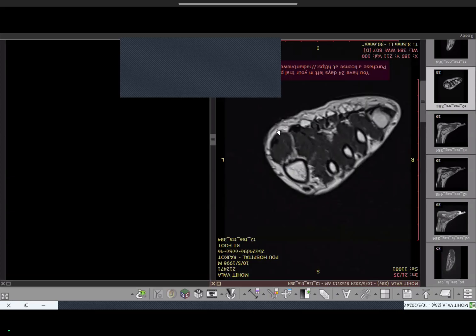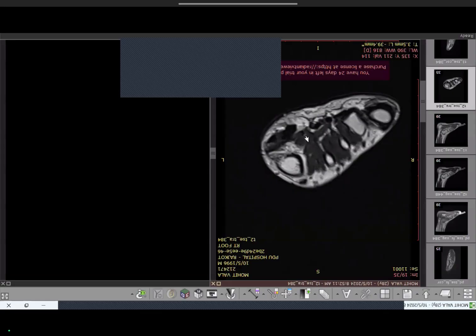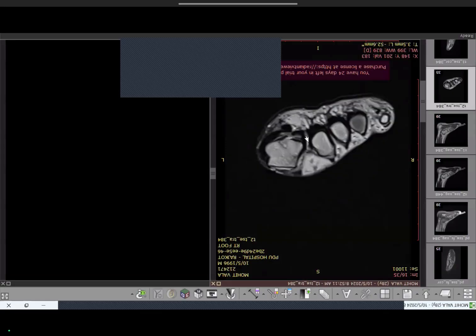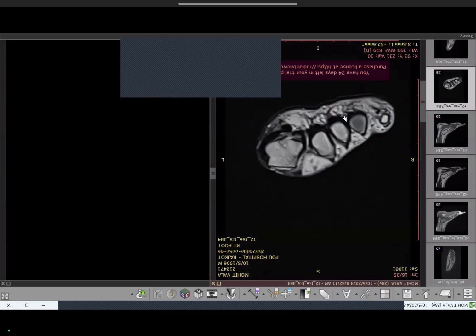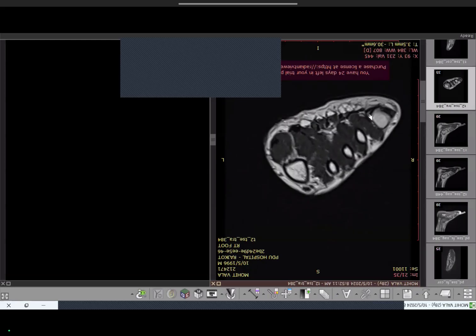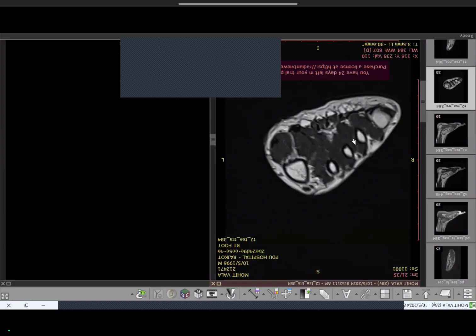The adductor hallucis — here is the horizontal head, or the second head, going and inserting at the head of the first metatarsal. The dorsal and plantar interossei are at the level of the metatarsal bones. These complete our review of the sole of the foot anatomy.